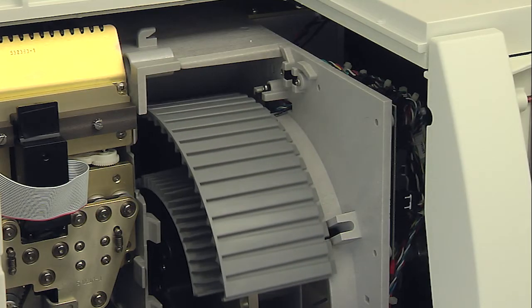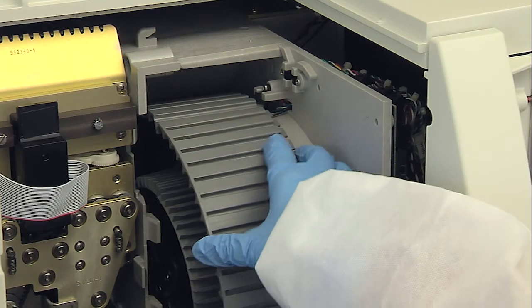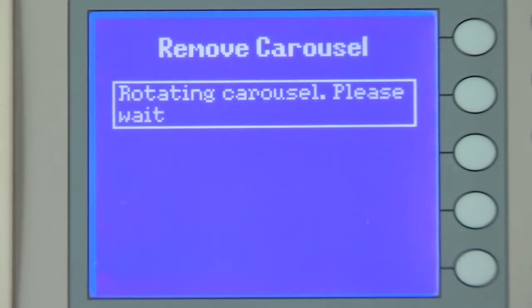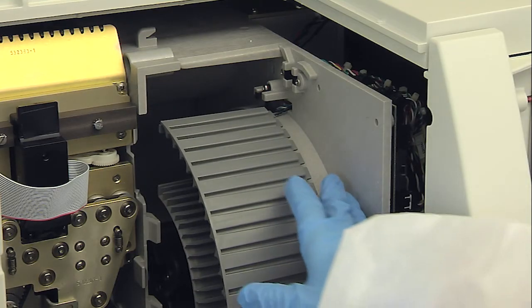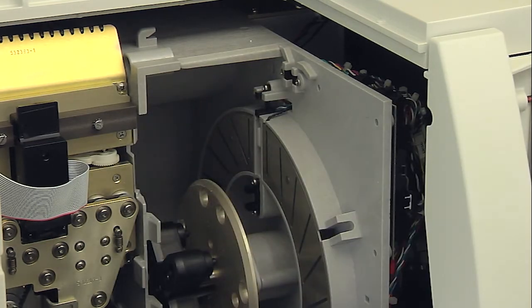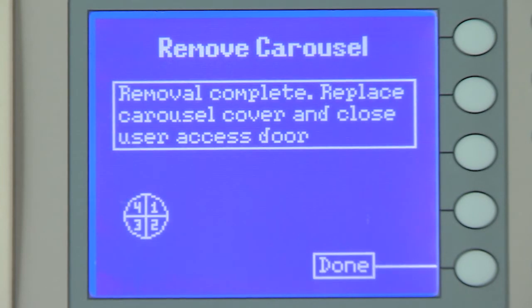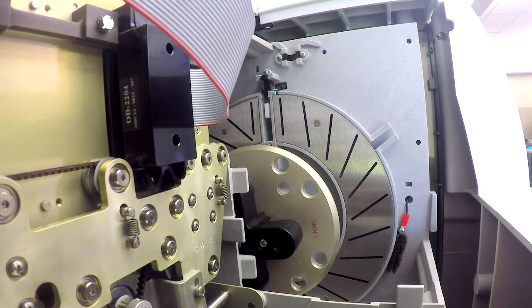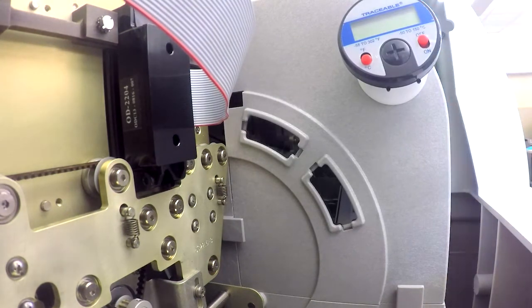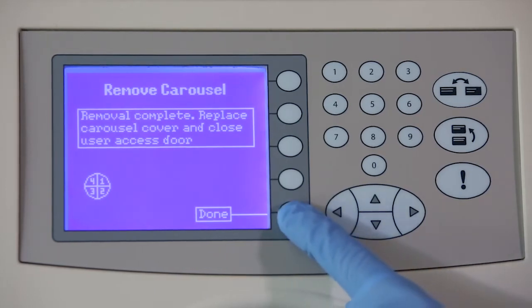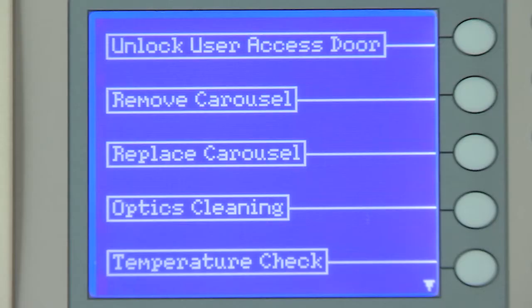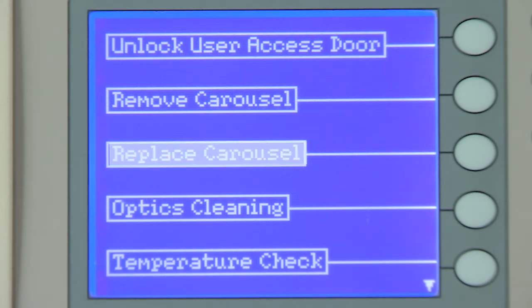Press the corresponding function key to the right of Done. Repeat the previous steps until all sections have been removed. Once all four carousel sections have been removed, the following message displays: Removal Complete — Replace Carousel Cover and Close User Access Door. Install the carousel cover by sliding it into place over the carousel. Press the function key for Done and the user interface returns to the Maintenance menu. If the carousel sections are to be immediately replaced with a previously cleaned and dried second set of sections, the Replace Carousel option may be chosen here.